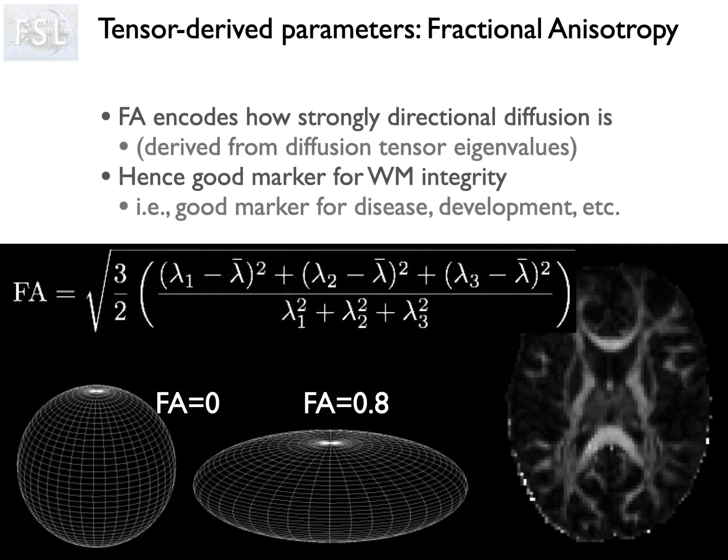In the earlier video on diffusion tensor imaging, we saw how we can derive some scalar measures from diffusion images, such as FA and MD. So the question is, what do we want to do with these measures? And typically, we want to compare them across subjects. That is, to correlate them with something like disease severity, or compare them between different groups, like disease versus control groups, etc.